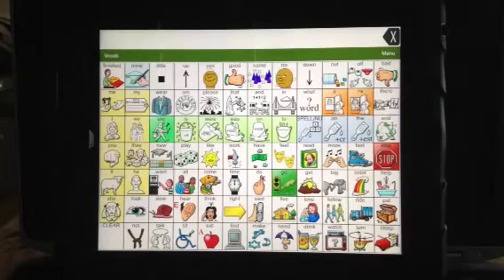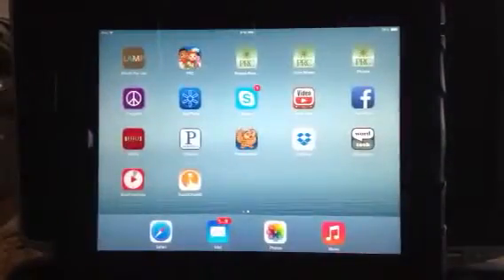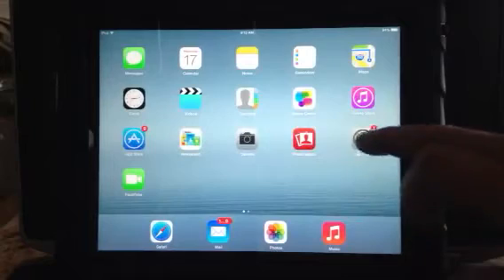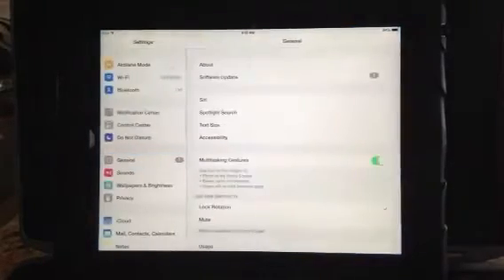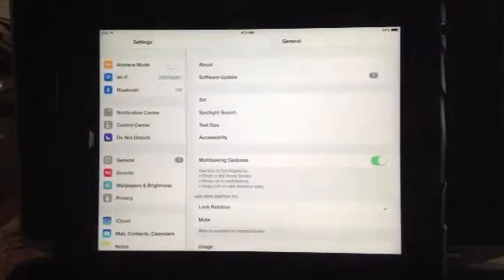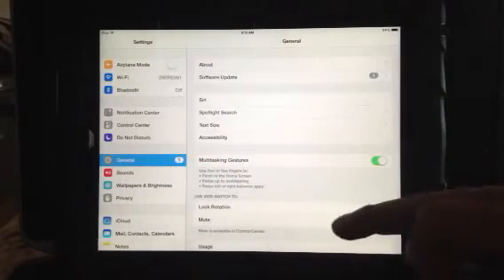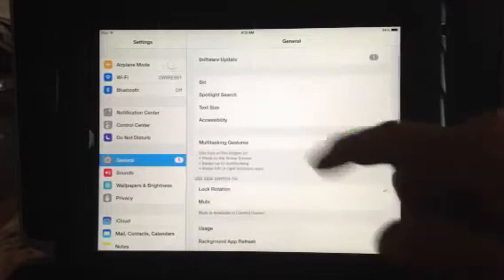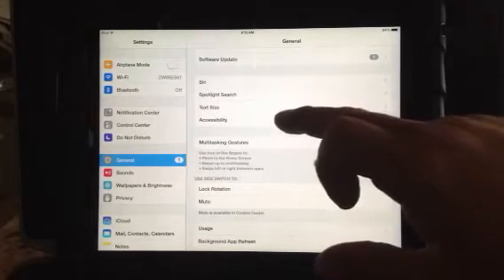So what we're going to talk about is Guided Access and how to use it. First, we're going to learn how to turn on Guided Access. Just get out of the app you're in, then go to the Settings menu, which most of you know how to find. Then go to where it says General, and scroll around a little bit — sometimes you have to go up or down — and look for the one that says Accessibility. Hit that one.